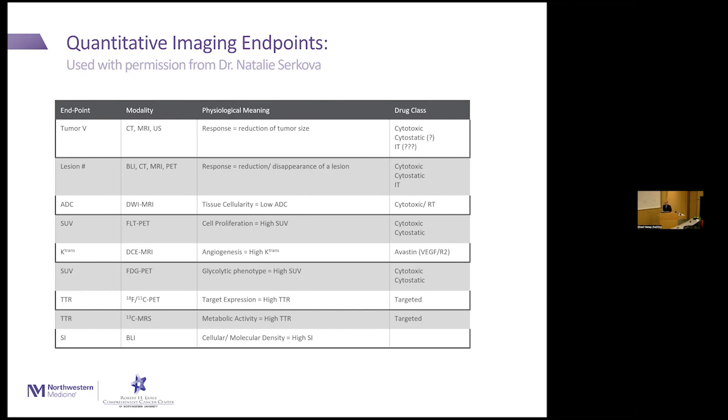Proton spin, are there features that intensify MRI? Yeah, so going back to that slide where we're talking about relaxation times, that's without contrast agents. The main thing you do with the contrast agents is look at the response to the agent. It's kind of misleading. You rarely are imaging the agent itself. You're imaging the effect it has on protons. But we do have some targeted agents. So in a sense, you're imaging those.